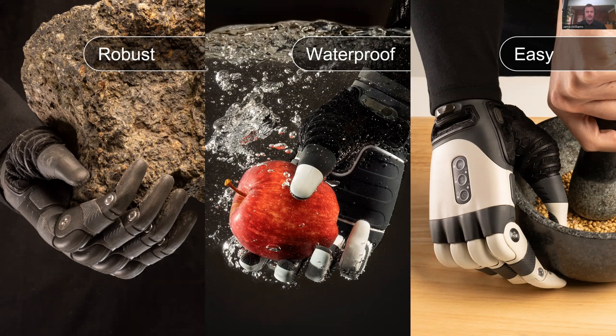Waterproofing is another important pillar — every one of our hands is IP67 waterproof, and I'll talk more about that shortly. Just like robustness, that means you can use the hand for a wide range of activities without worrying about damage. At the end of the day though, if you've got a robust waterproof hand but it isn't easy to use — whether in the office, around home, in the kitchen, or out socializing — it's a problem. So we've got features in there that make the hand easy to use as well.